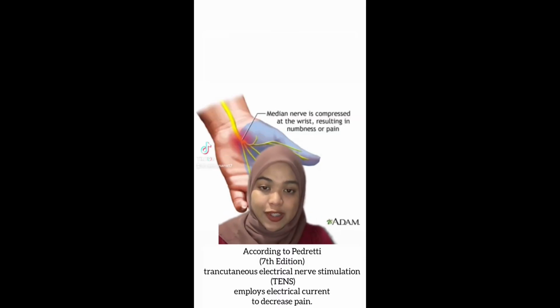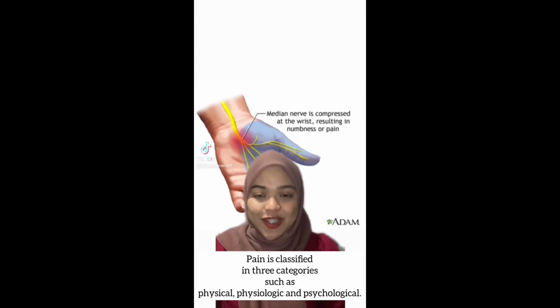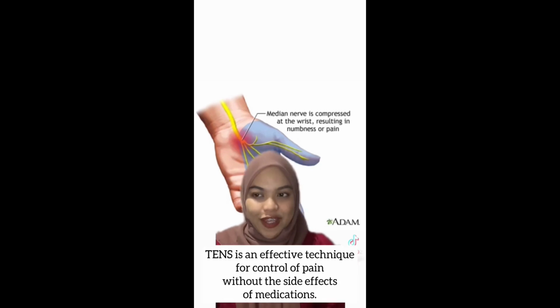According to Pedretti 7th edition, transcutaneous electrical nerve stimulation, TENS, employs electric current to decrease pain. Pain is classified in 3 categories such as physical, physiologic, and psychological. TENS is an effective technique for controlling pain without the side effects of medications.